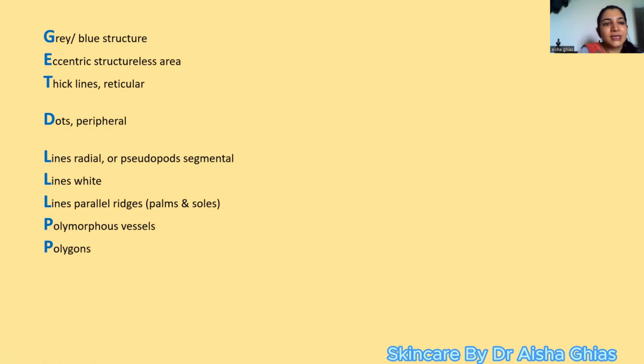So the mnemonic is GET, G-E-T, GET, and then D se hai ji dermoscope, get dermoscope. L, there are 3 L's, so 3 points for your learning. Why are you going to get dermoscope? Because you want to learn, so 3 points for your learning and 2 points for your passion. Some people do have a passion of viewing dermoscopy in clinical practice because they do not want to be lagged behind and they want to keep pace with the world.